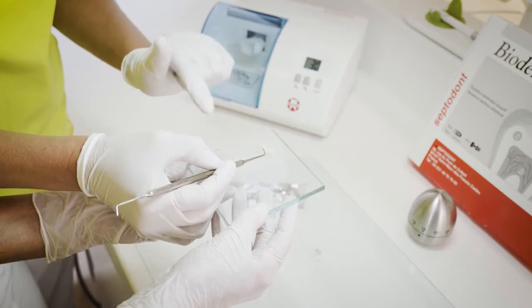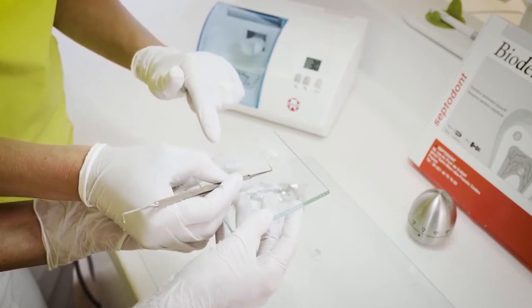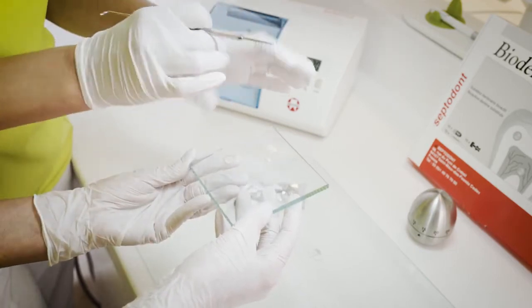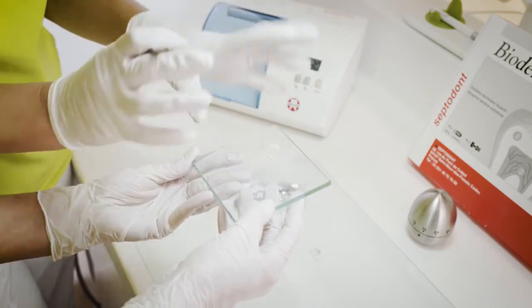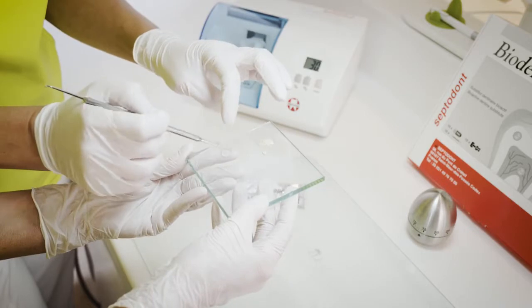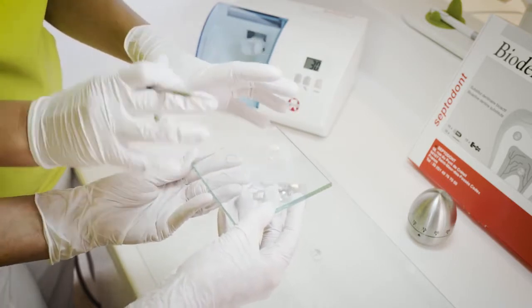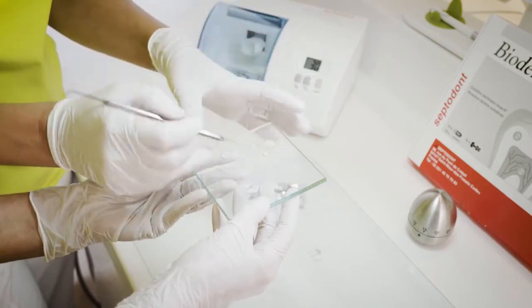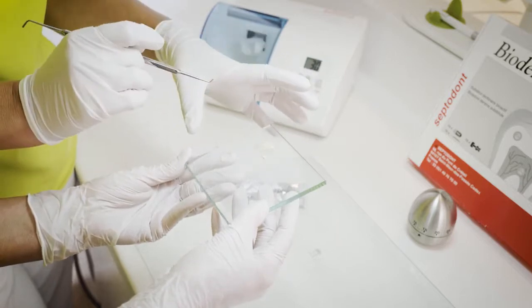What I'll use the liquid for — and you'll see me do this shortly — is using a little brush in there, brushing over the cavity to get it very slightly wet using that same liquid. I don't want it pooling, just very slightly wet, so when I carry the material to it we've got a little bit of tack to draw the material down into the cavity in the position I want it.